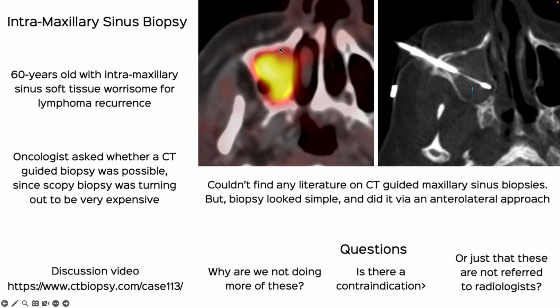And just a couple of examples. This was the intrasinus I did, and the reason the oncologist sent this to me was because the patient couldn't afford to go to an ENT surgeon and then get a procedure done, etc. And I just thought this was so simple and straightforward that I couldn't find any literature on a CT guided maxillary sinus biopsy, but it's so straightforward.